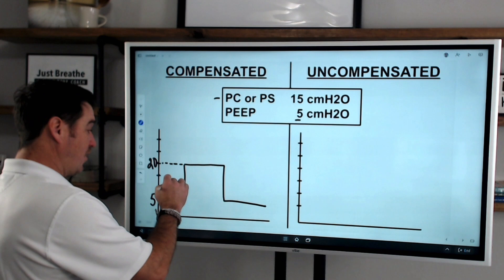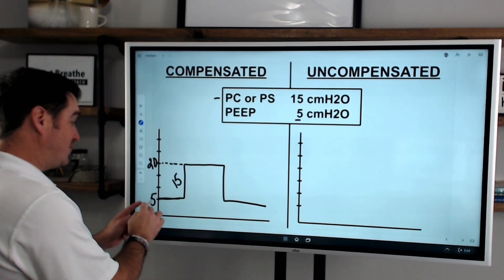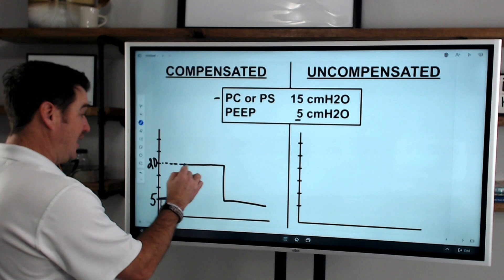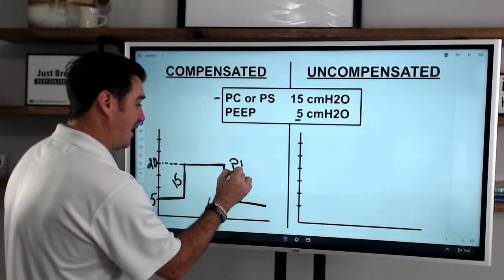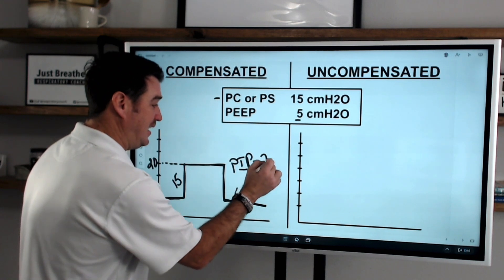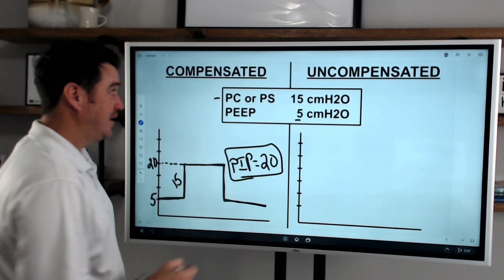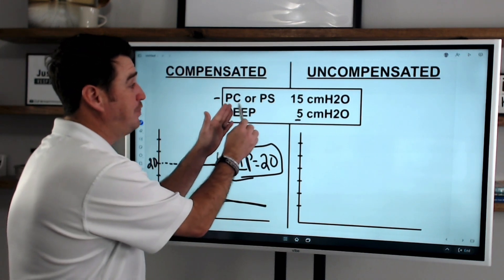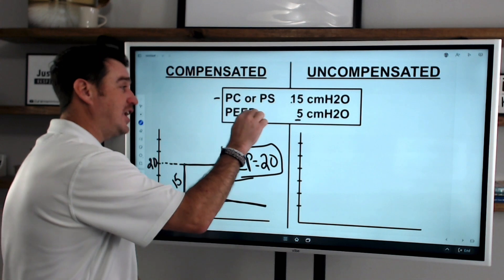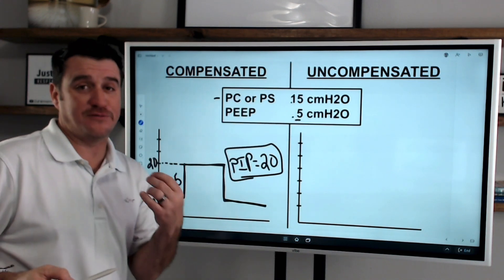So, you can see where here we put the delta P of 15 here, held it and then returned back to baseline. So, this actually made our PIP equal 20. This is when you're compensating. See, the ventilator understands that, okay, I'm going to put this 15 on top of this PEEP of 5.